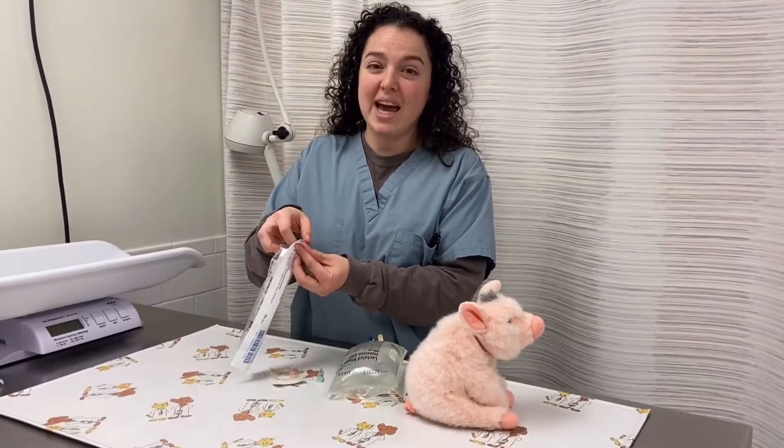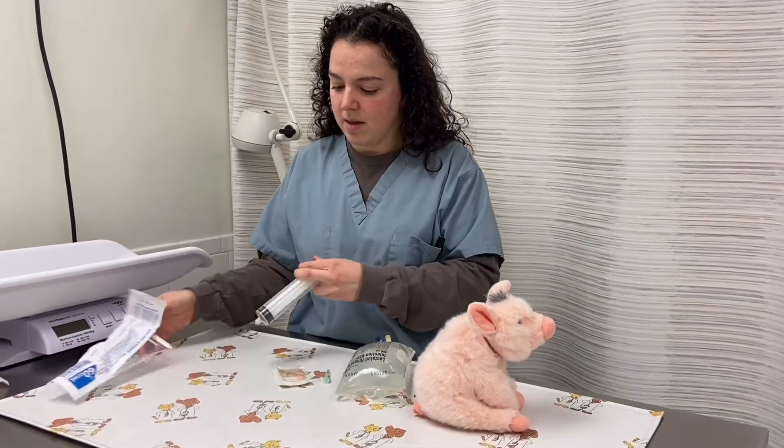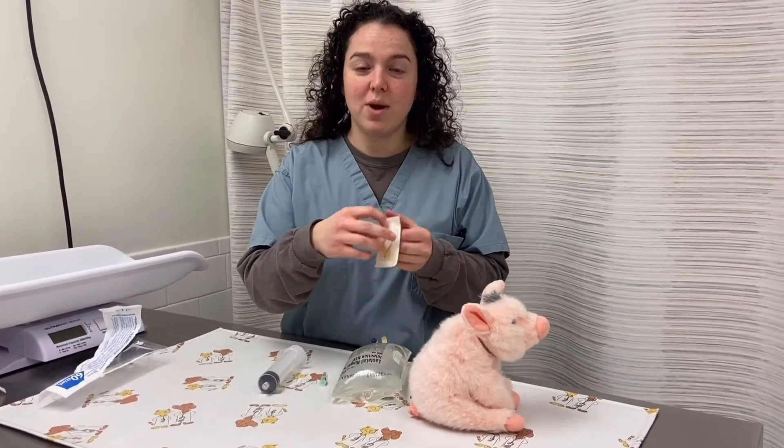The syringe will be opened using a tab at the top of the covering. The butterfly needles also have a tab at the top.